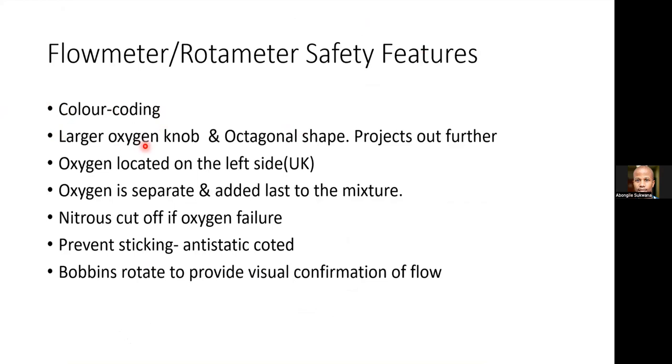And the size and shape tends to differ. So for oxygen, it's larger and it's octagonal in shape. Don't ask me how an octagonal shape looks like. And for oxygen, it projects out further as compared to the other rotameters.